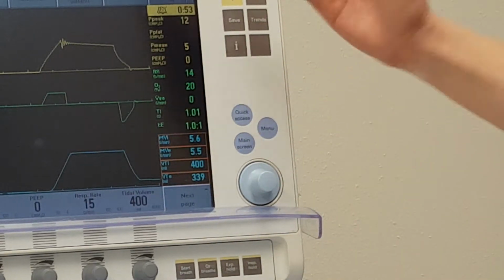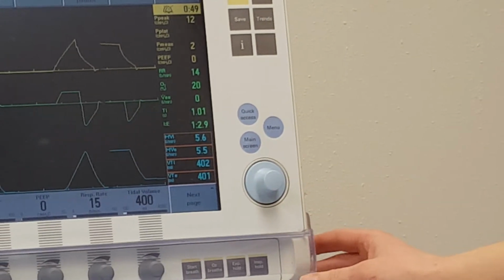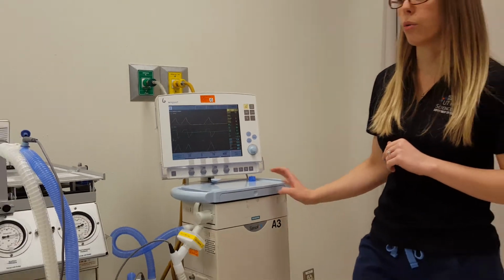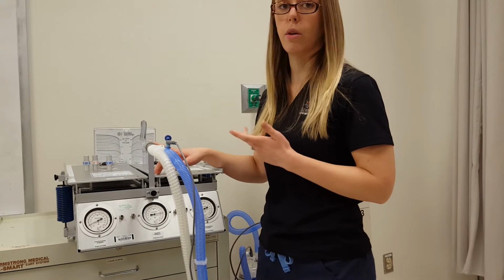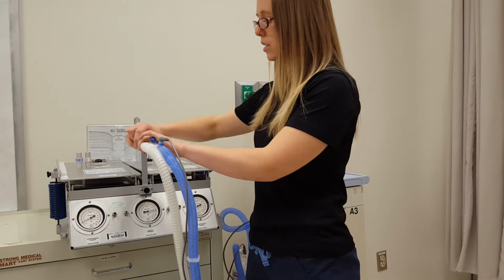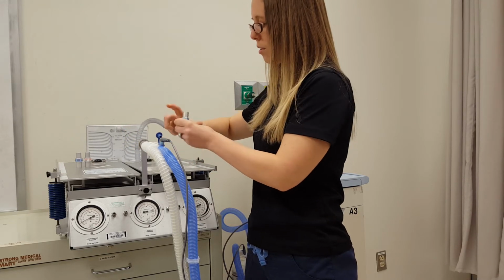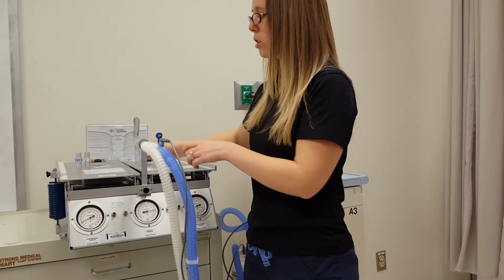10. Kind of an 11, 10. So on our next vent change, we're going to actually change our Raw. Over here on the lung, we can go from 5 to, I believe it says 20. So all we're going to do is disconnect, switch that out, and what should we see happen?